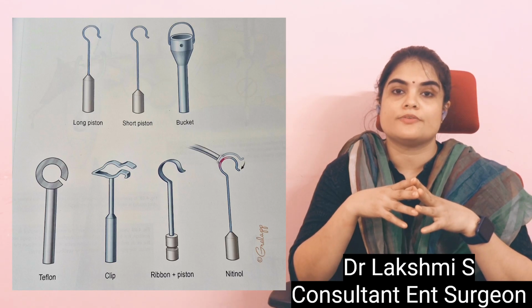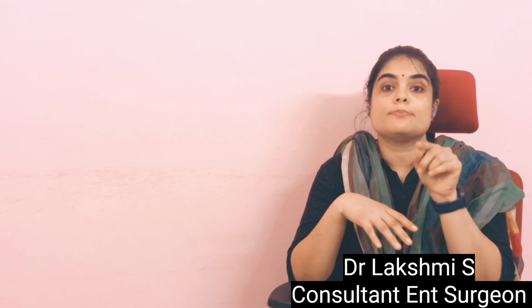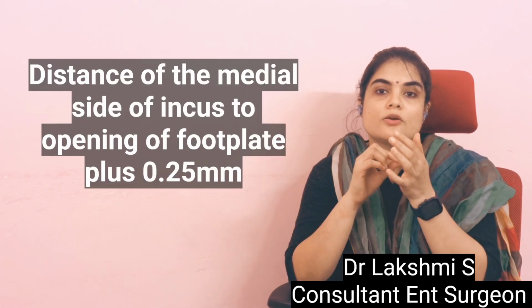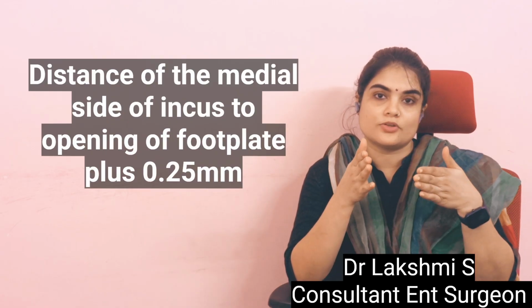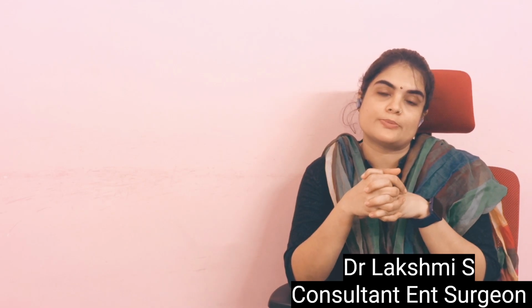Actually, the length is measured from the medial aspect of the incus to the center of the fenestration plus 0.25 mm, because the piston has to go into the vestibule around 0.25 mm. So that is the length of the piston used. Usually it is around 4.5 mm.